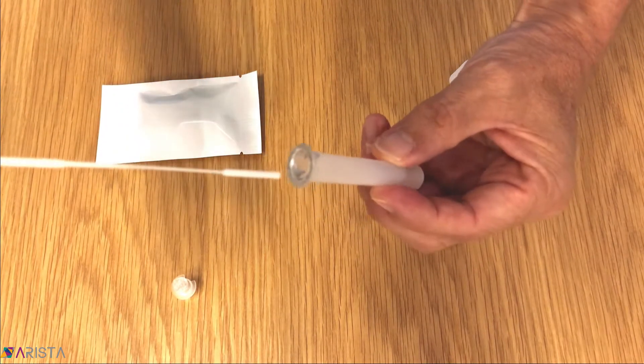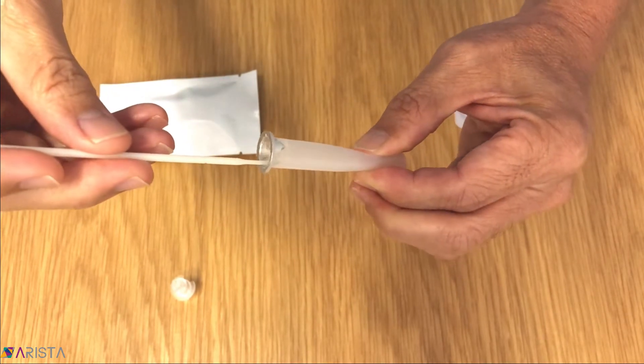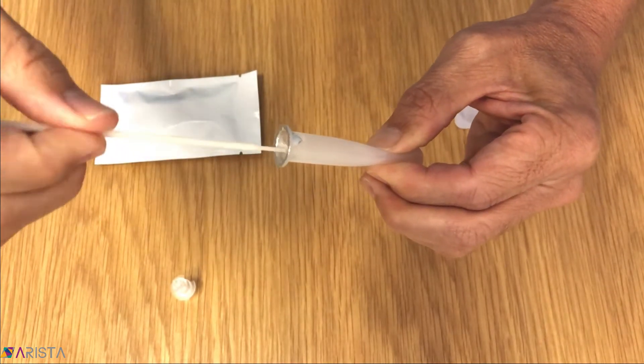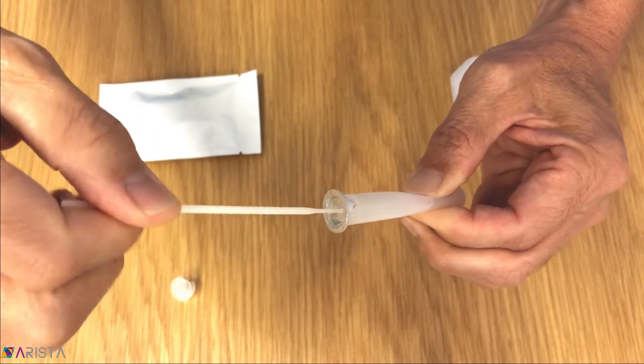Fully immerse the swab sponge tip into the diluent. Then squeeze the tube against the swab tip and rotate the swab stick in a twisting motion for 30 seconds to ensure all the sample is mixed into the diluent.